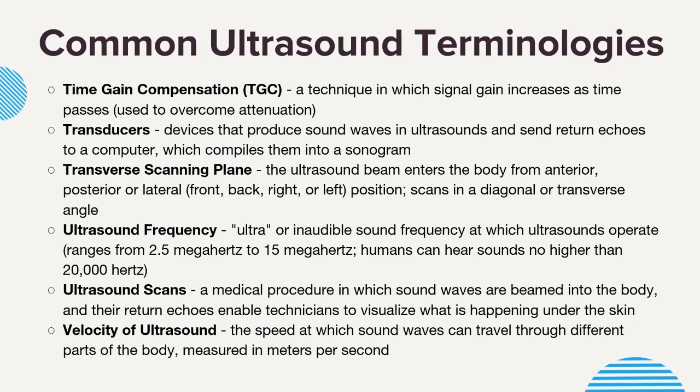Transducers: the devices that actually produce the sound waves in ultrasounds and send return echoes to a computer, which compiles them into a sonogram. Transverse scanning plane: the ultrasound beam enters the body from anterior, posterior, or lateral, front, back, right, or left position. Scans in a diagonal or transverse angle.